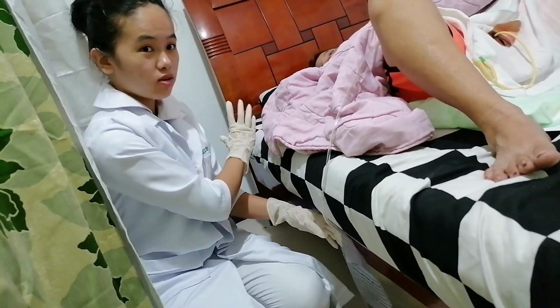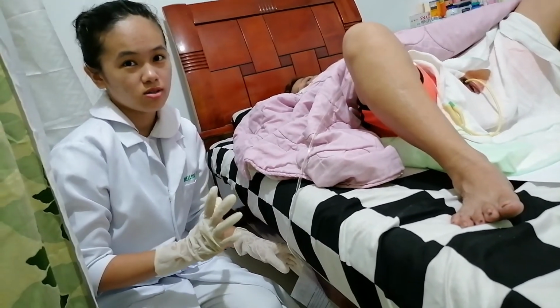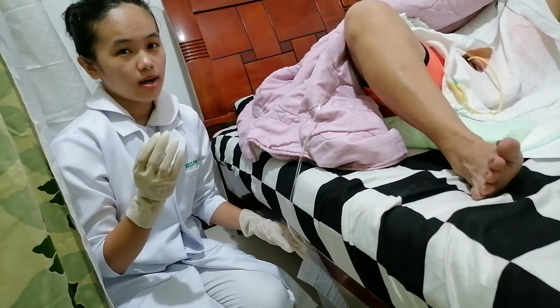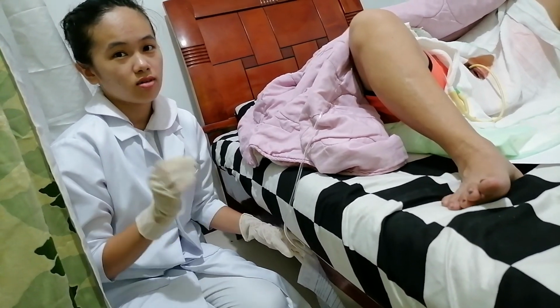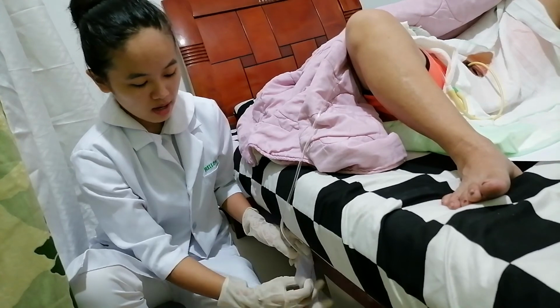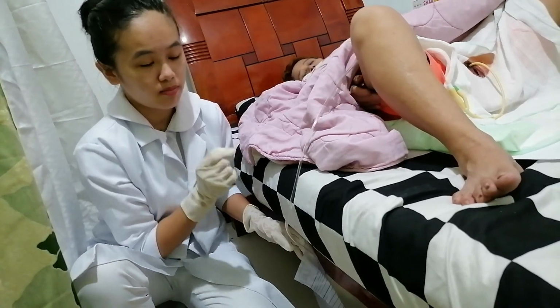It should not be near the breast or near the foot. It's not allowed because we are here for the safety of our patient, and as a nurse, we must avoid retention and any infection or backflow of urine. So, I'm going to put the urinary bag below the waist level of the patient.